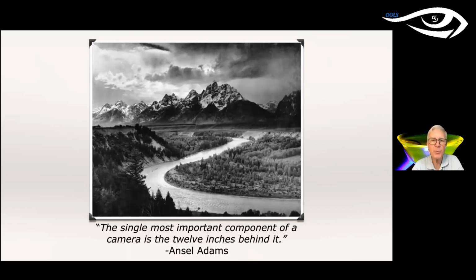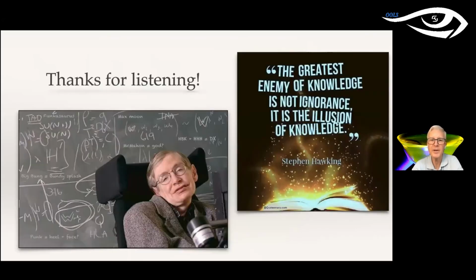So if it's out of focus, these editors won't help you. It is really important when you're capturing these images to pay attention to the focus, the lighting, the exposure. Even the color temperature can be altered, but you can't improve the focus of a blurry image. So pay attention to that. Try to get the clearest shots that you can. Thank you for listening.